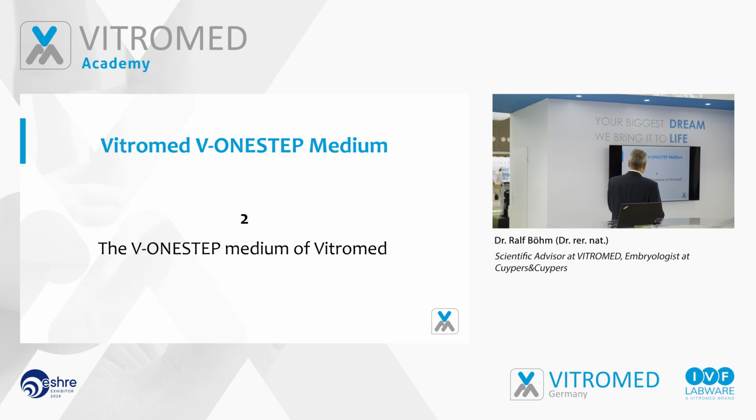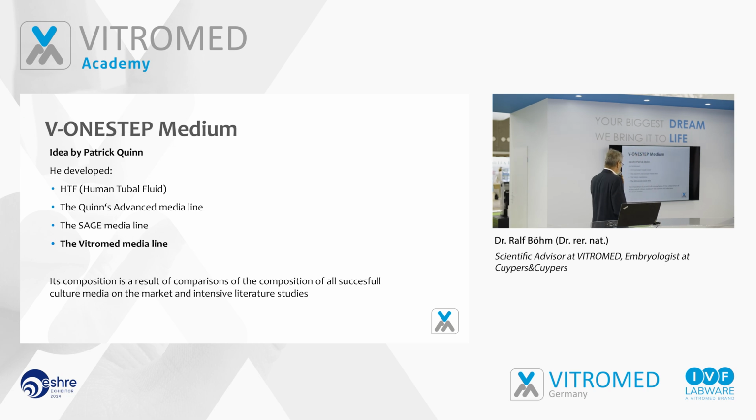Second chapter, the idea behind this medium came from Patrick Quinn. I think most of you who have been in IVF for a longer time know him. He passed away, I think, 2 years ago. But he's really famous because he was the one who developed the HTF, human tubal fluid medium, that is more or less based on the fluid you can find in the tubes, and he made more or less a copy of it to use for embryos.